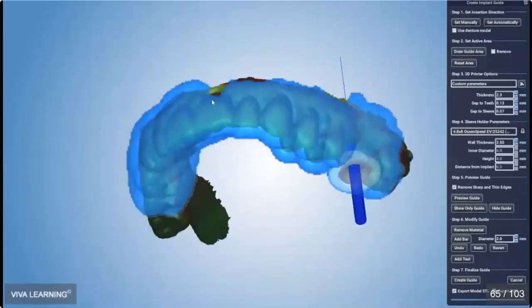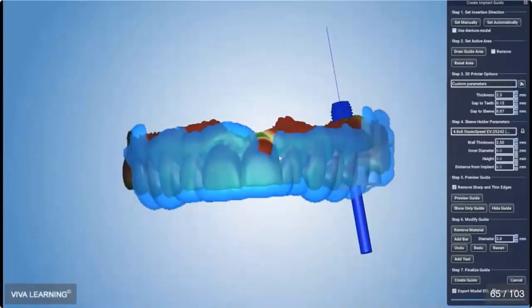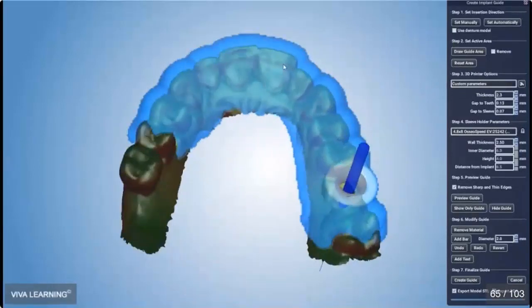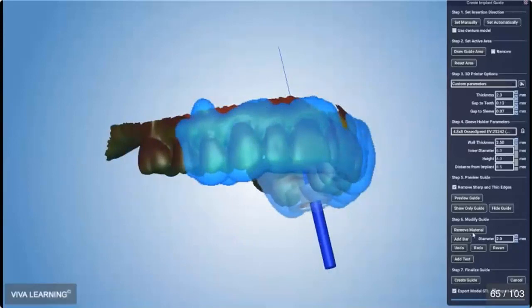And it's going to give you a proposal with some of the undercuts blocked out. At this point, you just trim it really quickly. You can decide based on your surgical strategy and design: do I want to do this case flapless, or would I prefer to flap it?